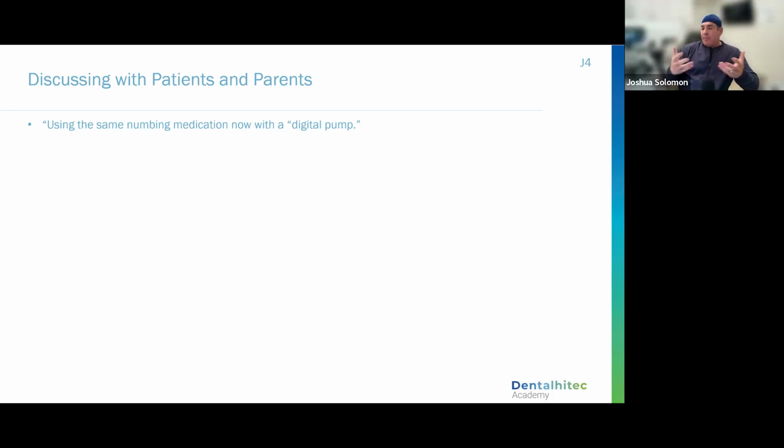I think it's important to let parents know about what you're using, but my explanation is, I have a new device that I'm using to give local anesthetic. It's the same drug that I've always used. I don't want them to think it's some brand new drug in the market that I'm experimenting on their child. It's the same local anesthetic that I've always used. It just happens to be a digital pump. It's a way of delivering that same anesthetic in a fashion that's more comfortable for their child.